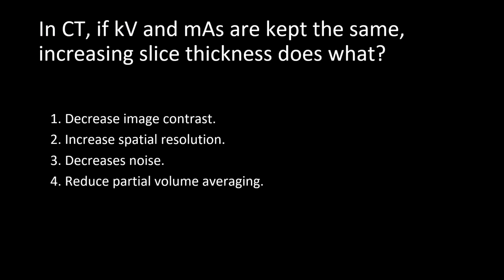In CT, if kV and mAs are kept the same, increasing slice thickness does what? Decrease image contrast, increase spatial resolution, decrease noise, or reduce partial volume averaging. Answer is 3, decreases noise.